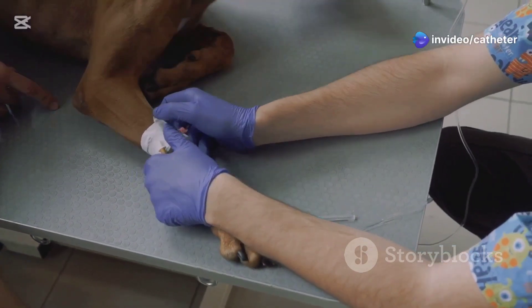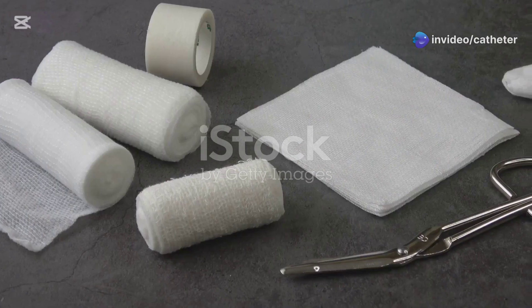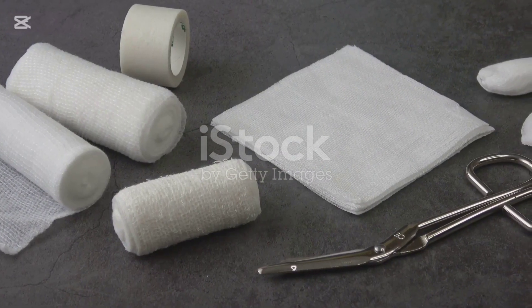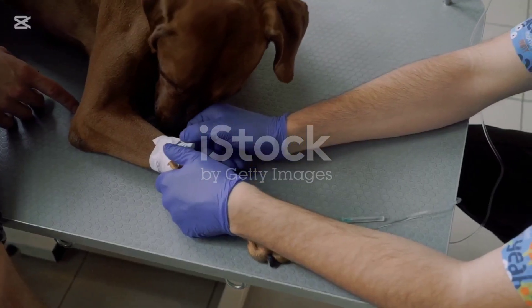First things first, always make sure you've got your materials ready. You'll need an IV catheter, antiseptic solution, gauze, adhesive tape, and of course your trusty gloves. Safety and cleanliness come first.